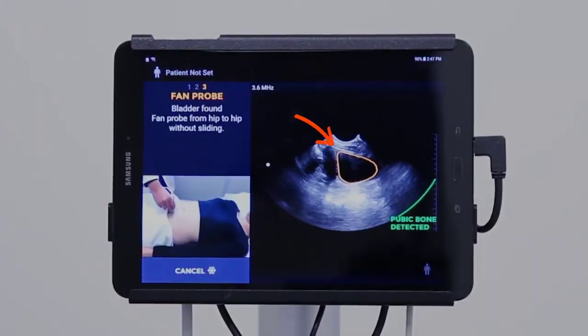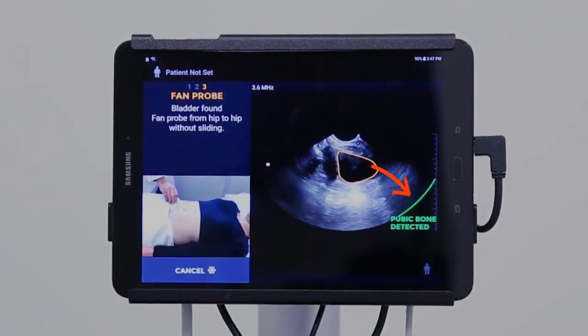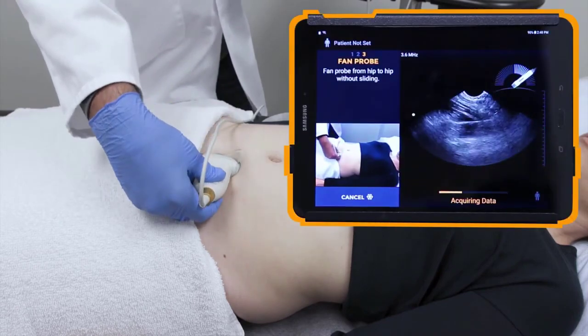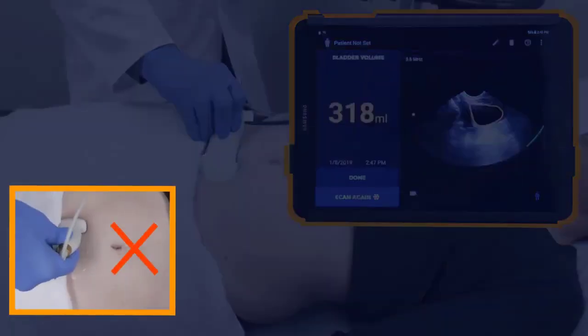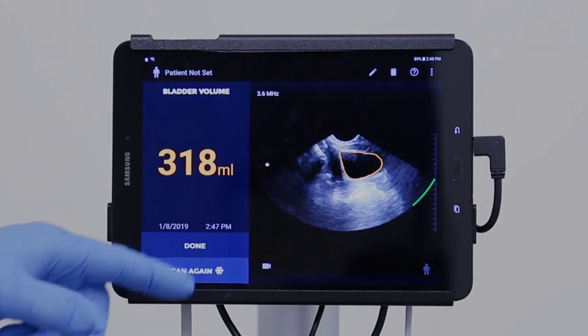When the bladder has been found, an orange outline will appear around the bladder. The pubic bone indicator will appear as a green curved line. Maintaining pressure and angle, fan the probe towards one hip until the sound indicator is heard and the arrow appears, then fan back towards the other hip until a second sound is heard. Make sure not to slide the probe when fanning. The bladder volume will appear on the display. If the bladder is fully outlined and the pubic bone indicator is present, no further scans are needed. Following a successful scan, press done and enter any requested information. You can either save the scan or discard it.